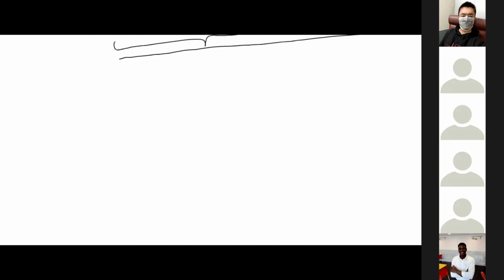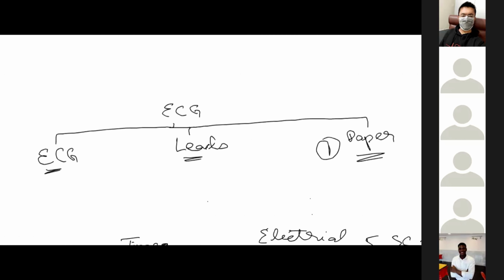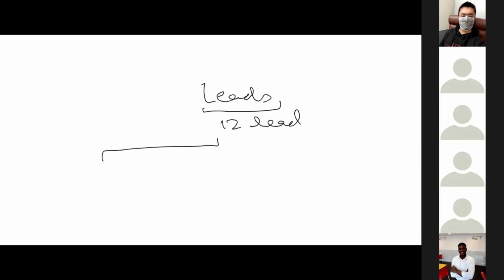Now, coming to the leads. We normally use 12 leads in ECG. Among these 12 leads, we have 6 limb leads and 6 chest leads.